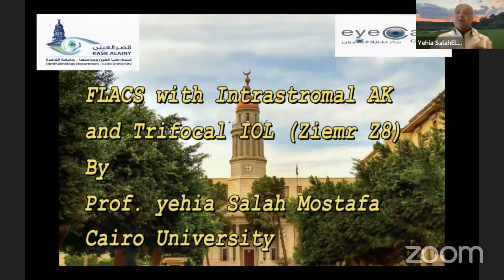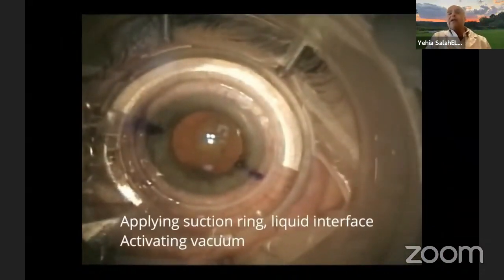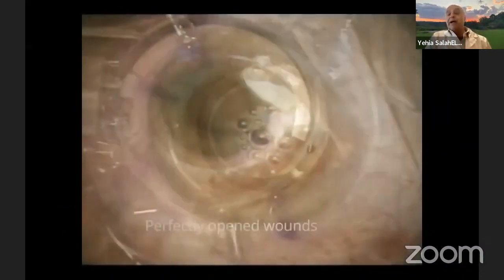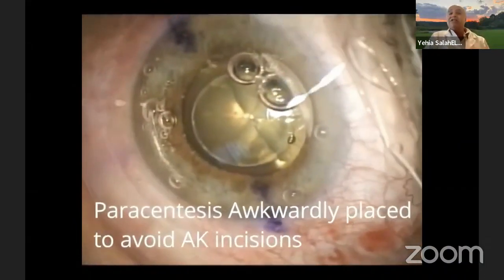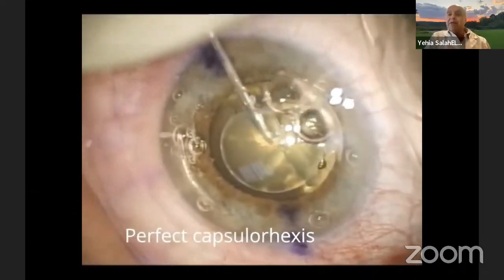Having femto-assisted cataract surgery can help us also to treat astigmatism, because as you have heard already, you cannot use multifocal or extended depth of focus lenses in astigmatism of more than one diopter. You can beautifully treat this degree, from 1 to 3 diopters, using femto astigmatic keratotomy, and I use, as you can see here, intrastromal astigmatic keratotomy. So my main indication here to use the femto was to correct the astigmatism at the same time.